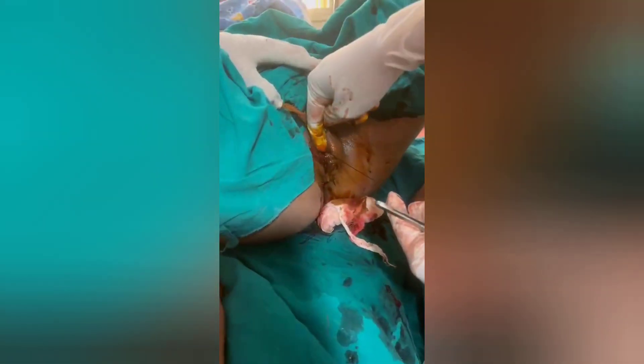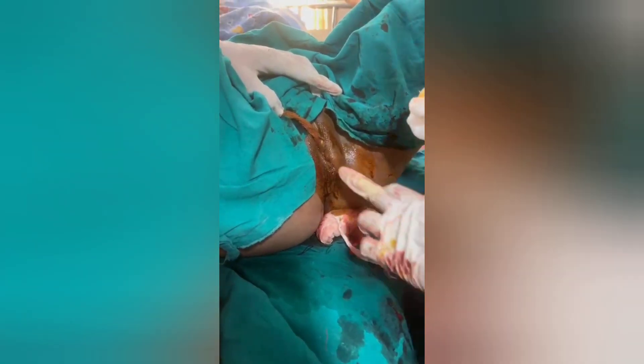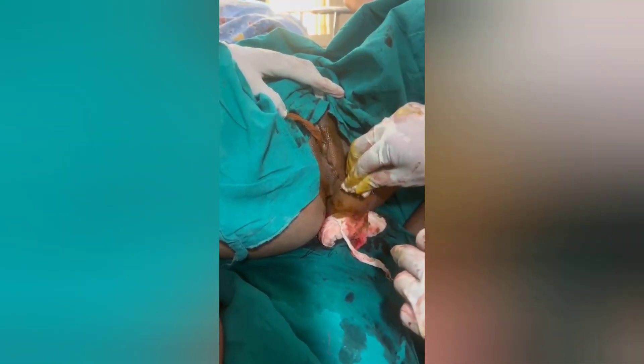Finally I buried the knot from inside out, and now I am just cutting the suture material. Nothing is exposed now, so the chances of contamination of the suture material with fecal matter — if the patient doesn't take proper perineal care — is also avoided.